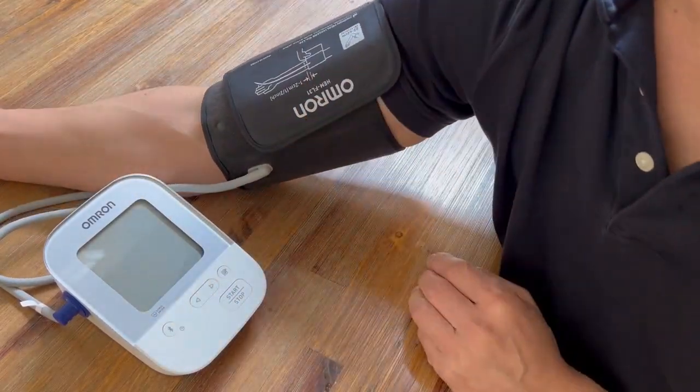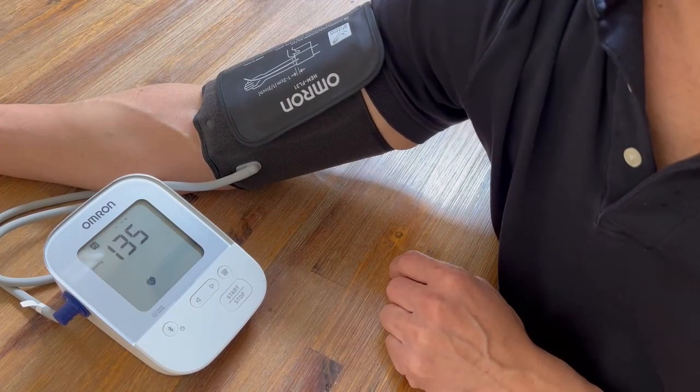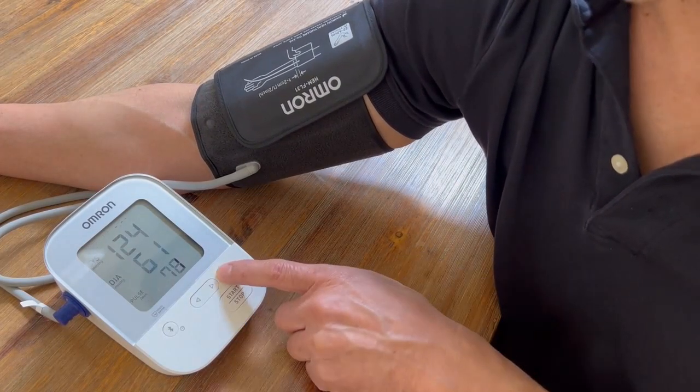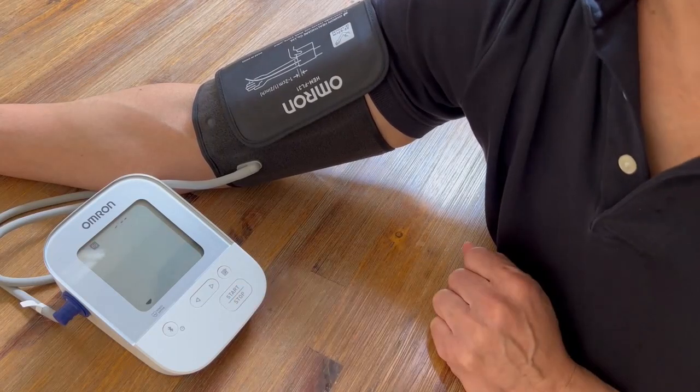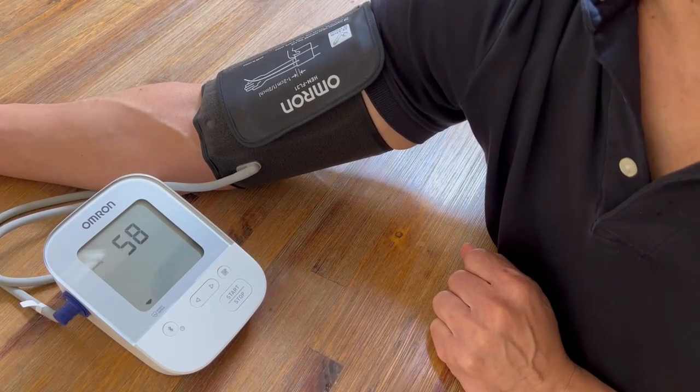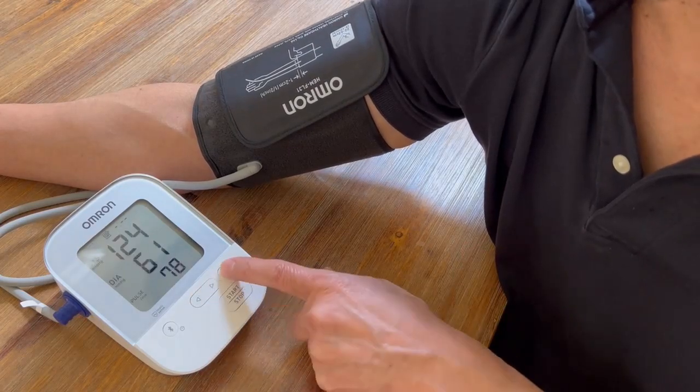It's also a good idea to get multiple readings. You can see here I did my first reading — it holds its memory and you can see the number one. Start it again and it's going to go through a second reading, logged as number two, so you can look at those and average them out.